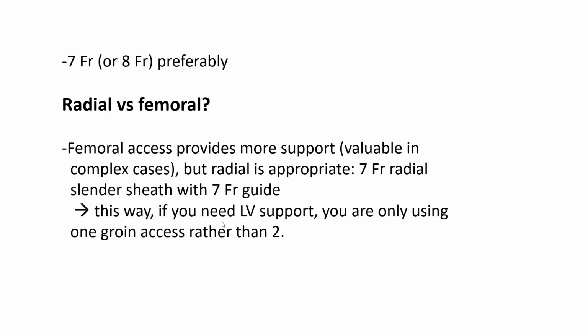Another idea regarding radial access: account for your skill level with radial and with complex PCI in general. Early in your career, tend to use femoral access for your complex PCI, then progressively try to switch to radial access. Also account for the amount of tortuosity and difficulty you have encountered during your radial diagnostic angiogram.